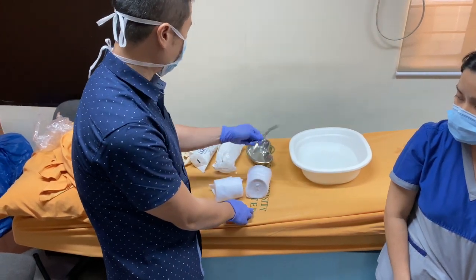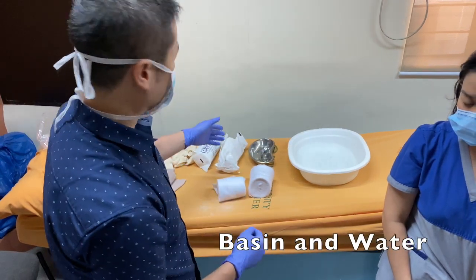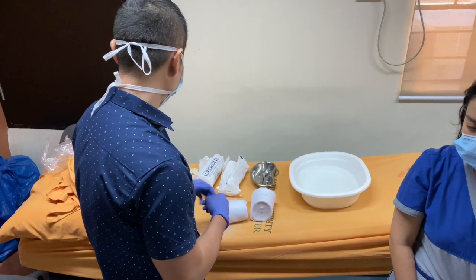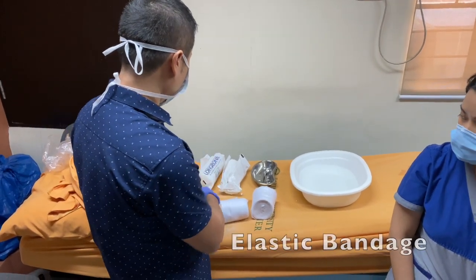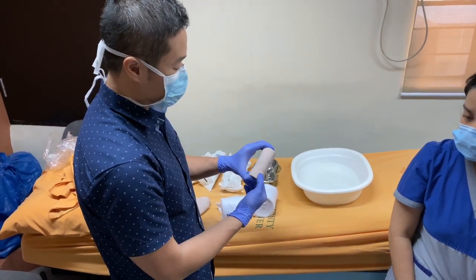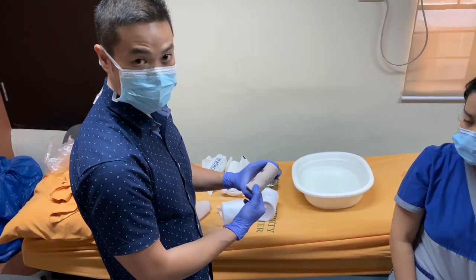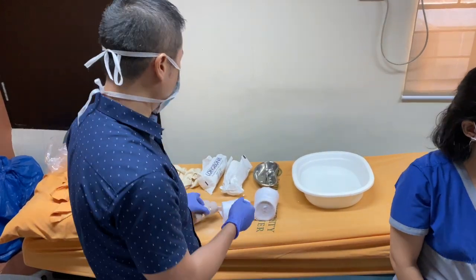We also use scissors for cutting the stockinette, and water to help set our POP or plaster of Paris. Lastly, we also use elastic bandage — this is a four-inch elastic bandage, appropriate for the size of our patient — to secure the splint or mold that will be applied.